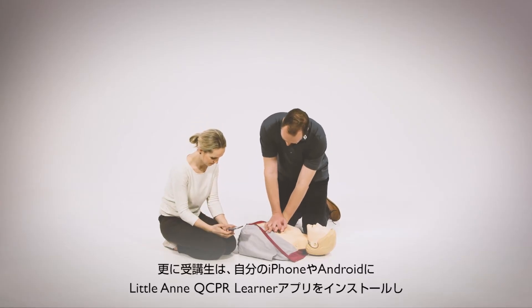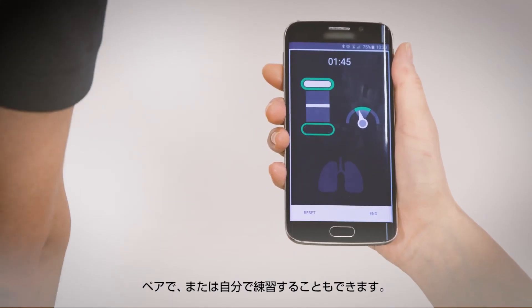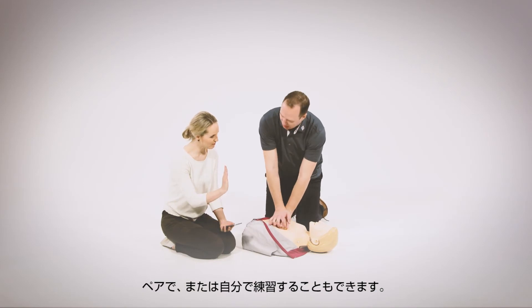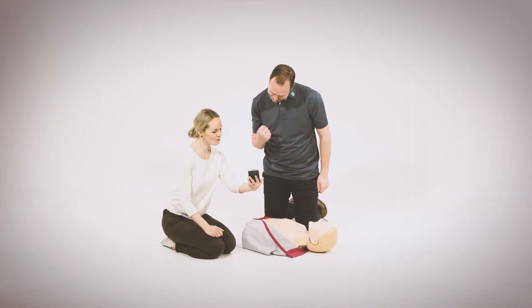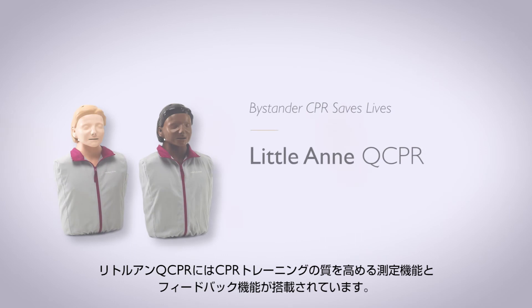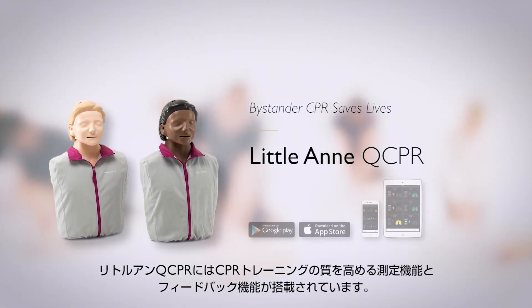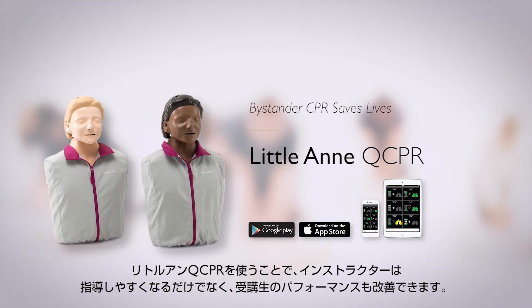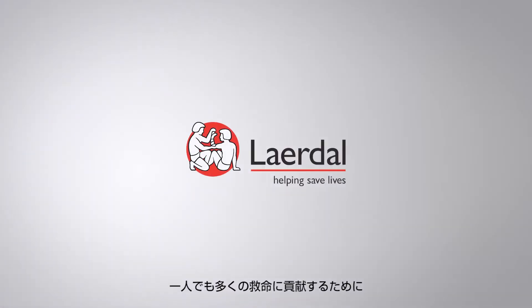It's also possible for students to use the Little Ann QCPR Learner app on their iPhone or Android to work in pairs or practice on their own. Little Ann QCPR includes measurement and feedback to improve the quality of your CPR training. Little Ann QCPR will not only make your job easier, but also improve the performance of your students, helping save more lives.